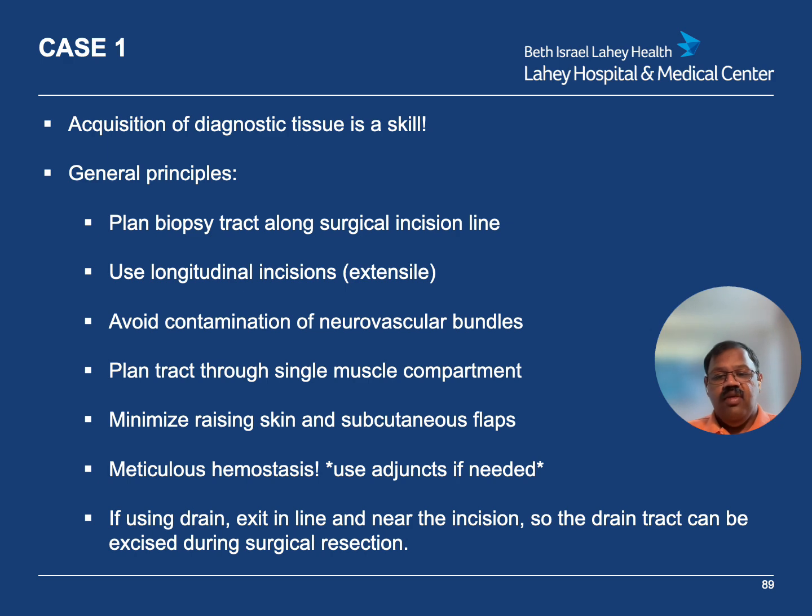So generally speaking, the majority of biopsies that we obtain today are core needle biopsies, and we usually have them done under some form of image guidance, either X-ray, CT, or ultrasound. If you have access to these imaging modalities in your institution, using that to plan and complete your biopsy with a core needle is oftentimes the best approach because it minimizes contamination and it can help preserve limb salvage options for treatment.